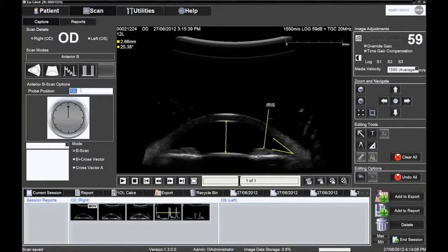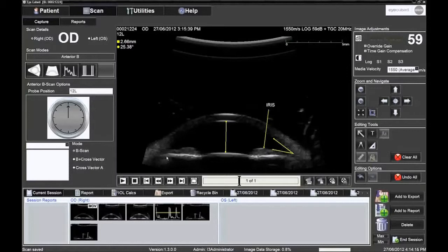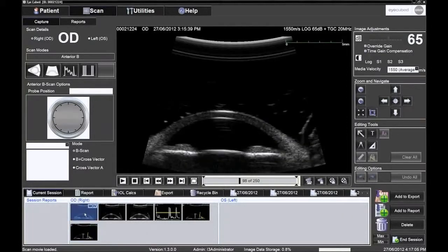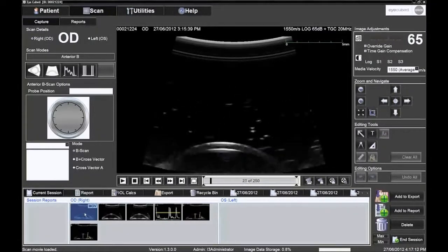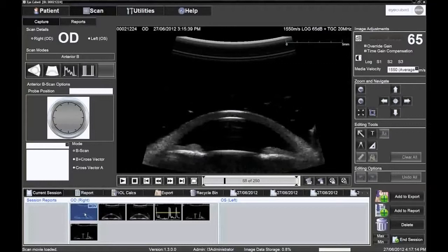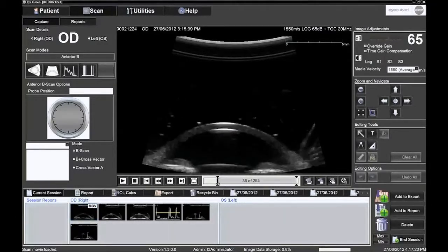The image that has been saved goes into the image tray for the eye being examined. A movie can also be stored. In order to save memory space, it is best to crop the sequence and only save useful images. Shorten the sequence by sliding the end markers along the bar and click on the third pictogram to save the movie.